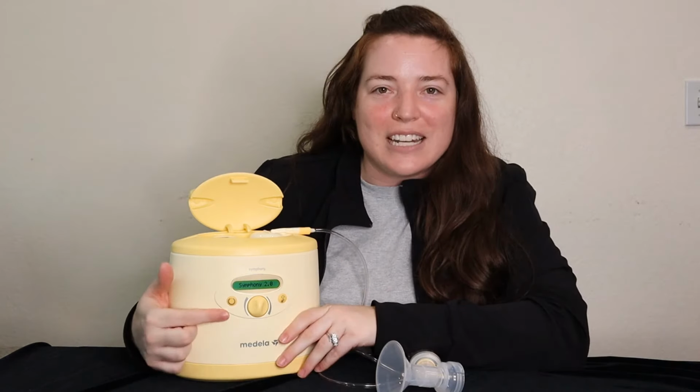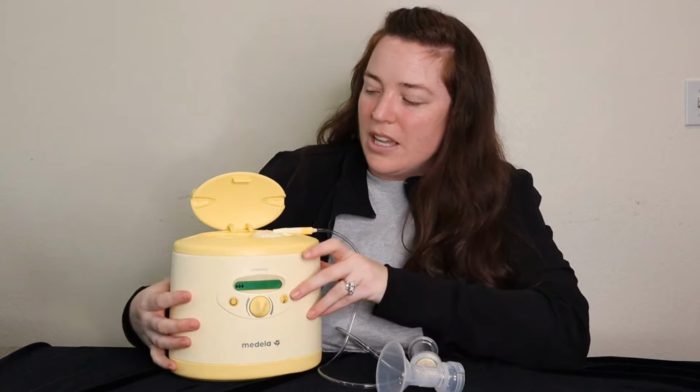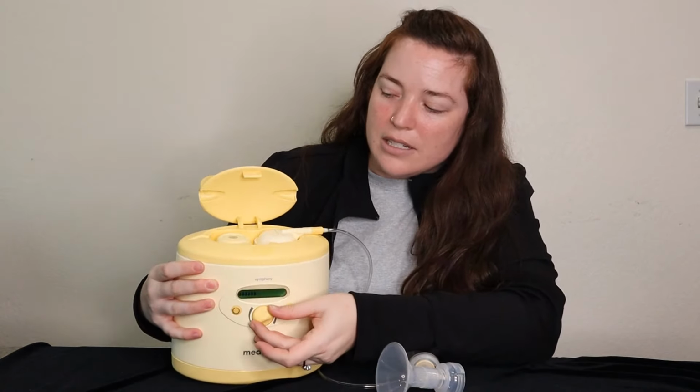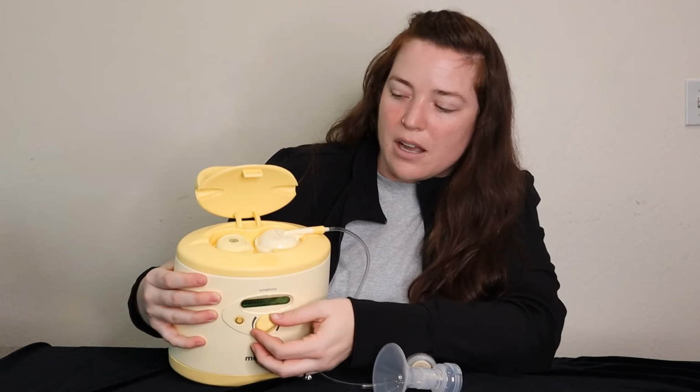So to start, I'm just going to hit this power button. It'll immediately start in massage or stimulation mode, and that's to go ahead and get your letdown to happen. And you can see this is moving pretty quickly. And we can turn the dial on the front to turn up the suction, and it also turns up the speed, or you can turn it down if that's uncomfortable.